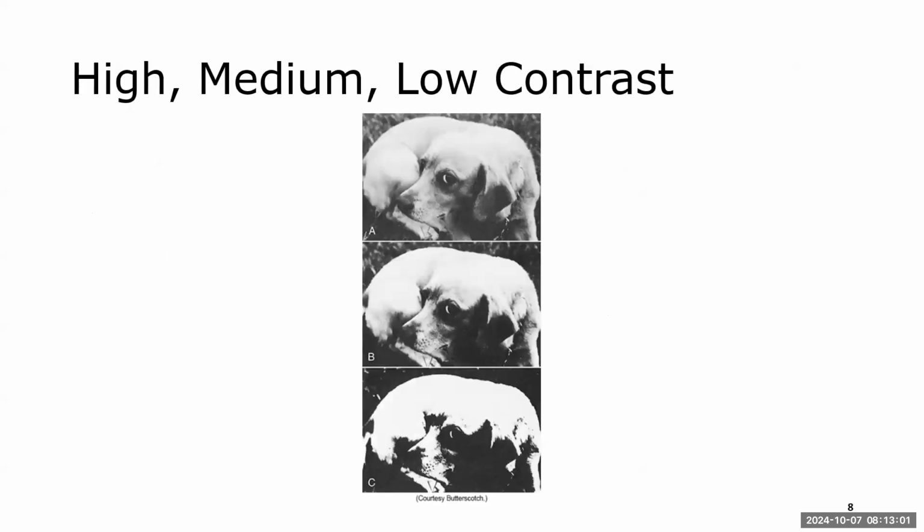So you can look at this picture and sort of see what we're talking about there. You don't want the contrast so low that you lose information, or so high. So which one is the highest contrast? Let me ask you this, the one on the top or the one on the bottom? On the bottom, C. C has the highest contrast because there's greater difference in those brightness levels.